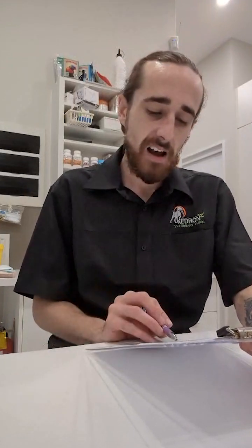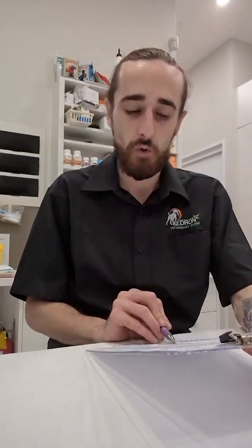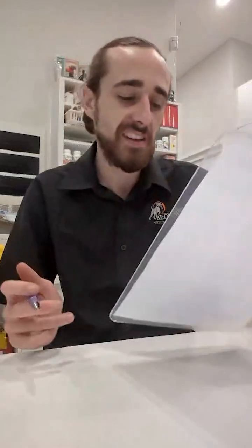We had no gingival recession, nor did we have any tooth resorptive lesions or any fractures, which I have noted. We did extract today the 401 incisor and the 404 canine, so I have noted them there with a cross to indicate that they have been extracted.